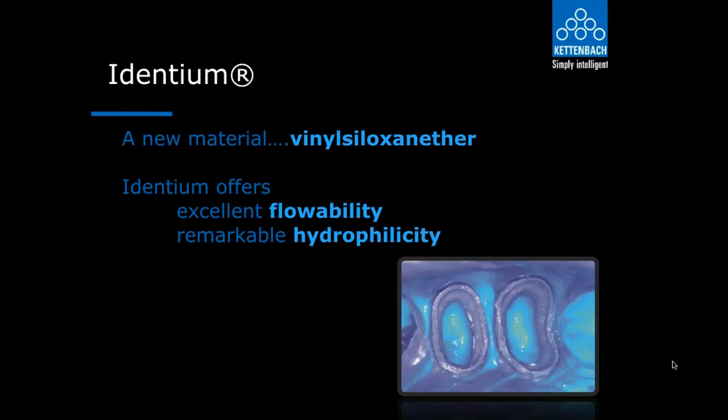If you were to do a smile makeover and adjust the gingiva with electrosurge, you would have to do it a week or two beforehand because it doesn't stay in that position. It has to heal. The beauty of a laser is when I remove a deep restoration like an amalgam, composite, PFM or a crown, and there's bleeding down there because of irritation, especially with PFMs and amalgams. I always tell patients that they can be the best flossers in the world, with the best hygiene in the world, and they'll still have that bleeding because of the oxidation of the metal of the PFM. You want to get rid of that diseased tissue, and that's why I like using that diode laser.